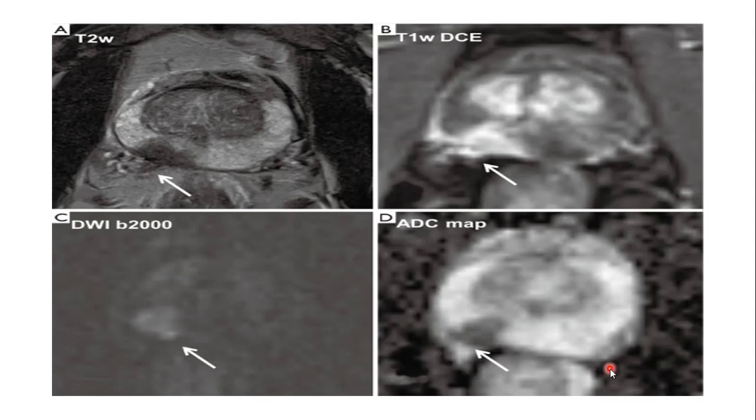There was a scintigram proposed for the detection of prostate cancer, known as the ProstaScint scan. It was based on the premise that if we develop a molecular marker for prostate cancer, then whether the cancer is confined to the prostate or has metastasized to the bone or anywhere else, that monoclonal antibody will go and attach itself to that area, and that will glow up on a scan. That might be out of fashion now, but it is still on the horizon, and there are many things available.